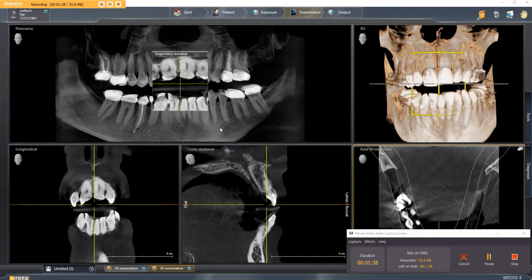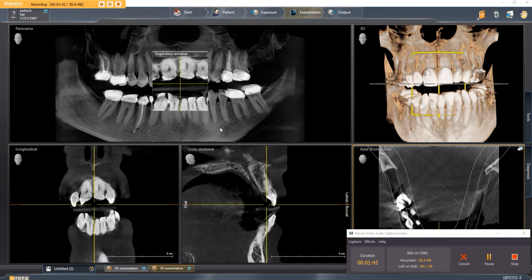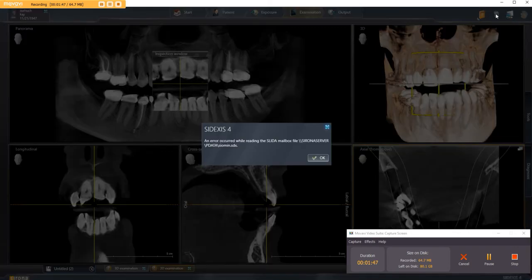To set up the communication partner, this is what you'll need to do the first time that you export to our laboratory. You go to settings up here in the top right corner.